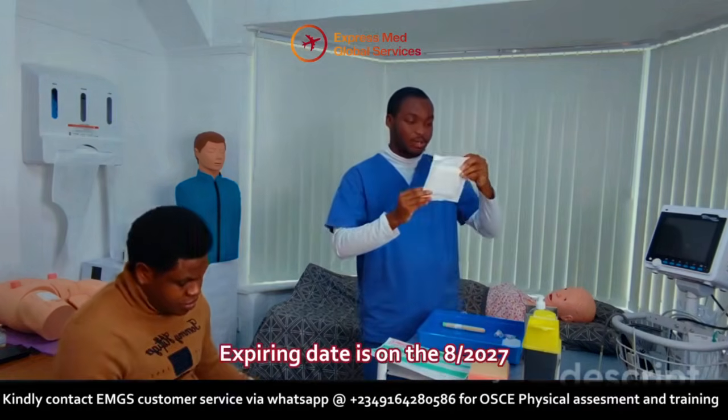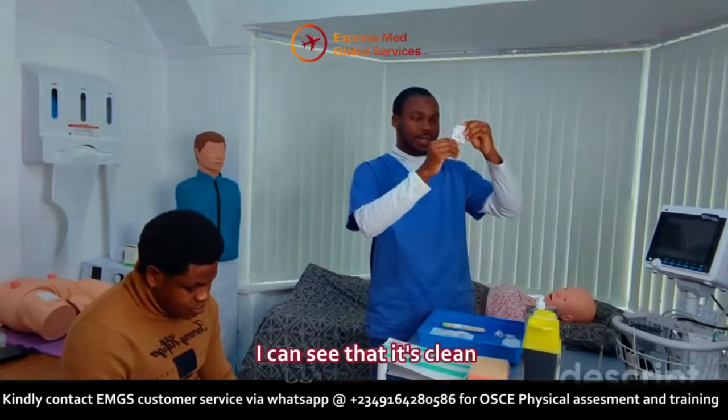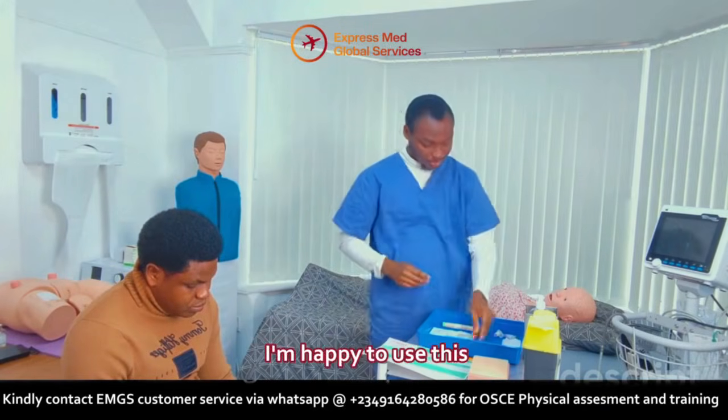The expiry date is on the 8th, 2027. I'm happy to use. I have the clean alcohol wipe. I can see that it's clean, intact, and in date. The expiry date is 2026. I'm happy to use this.